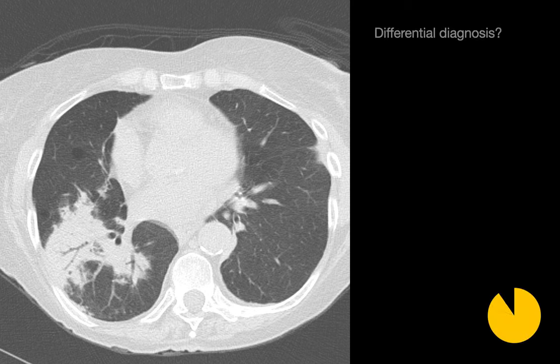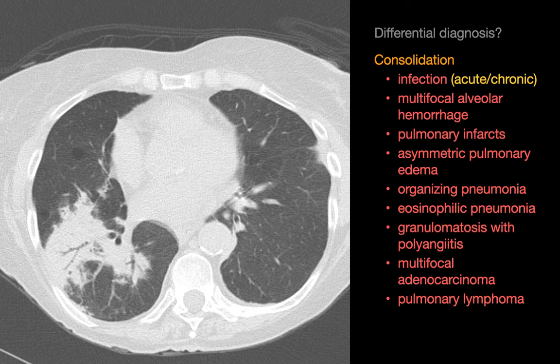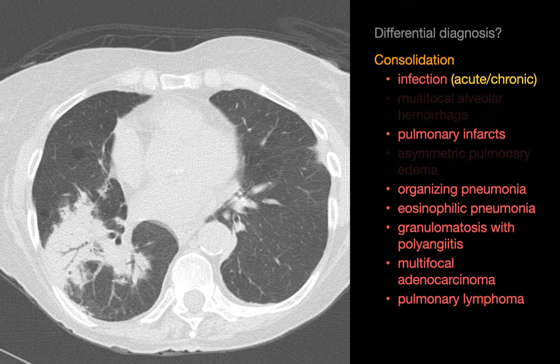What's your differential diagnosis for this lung opacity? The finding in this case is an irregularly marginated region of consolidation with internal air bronchograms. The consolidation is non-diffuse in distribution and could either be acute or chronic, resulting in a union of our differential diagnoses for non-diffuse acute consolidation and chronic consolidation. The uniformity of the consolidation and absence of substantial ground glass opacities would lead me to eliminate alveolar hemorrhage and asymmetric pulmonary edema. The non-peripheral tendency of this consolidation would also lead me to eliminate pulmonary infarct.